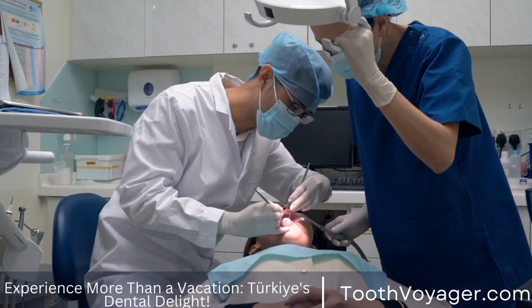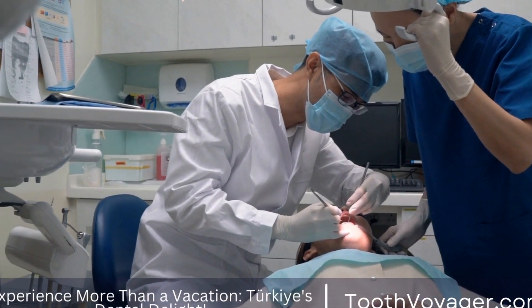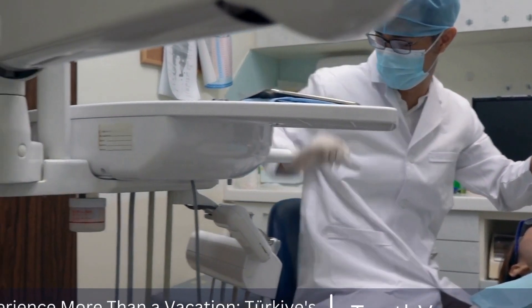In this video, we will explore the art of crafting dental crowns, focusing on the materials and techniques used in their creation.